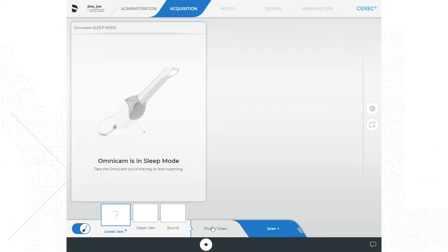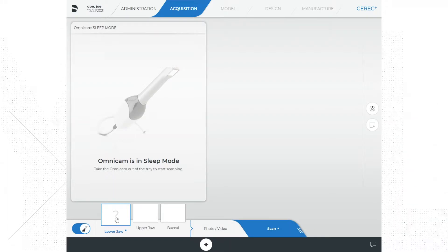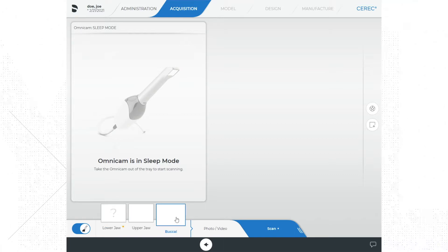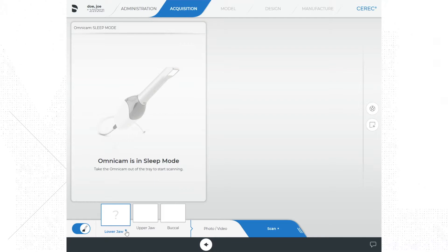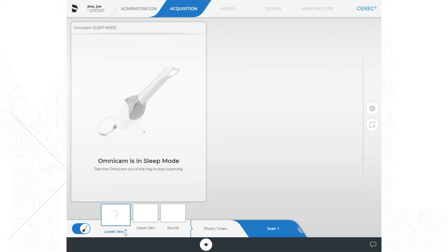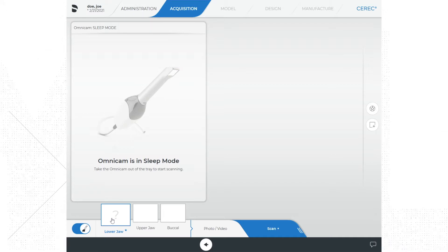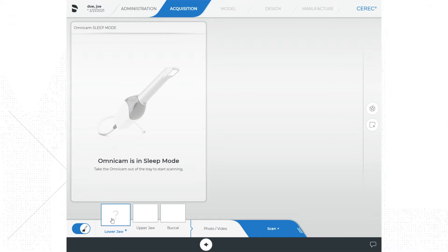Also on this screen, at the bottom left, is our catalogs. Currently we see a catalog for the lower jaw, the upper jaw, and the buccal scan. The lower jaw is selected and this is where our scan of the lower jaw will be located when completed. If at any point you scan the wrong jaw into the wrong catalog, you can simply drag and drop it to the correct location. If you do not like your scan and want to start a new scan, simply right-click on the catalog and delete the scan.